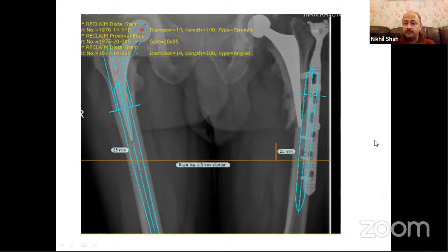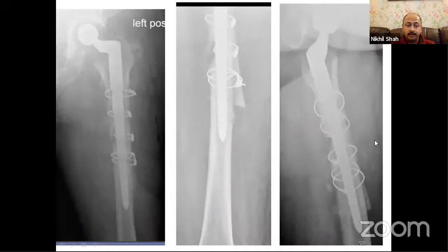So when I went in, unfortunately, the proximal femur, at least the 2 inches of bone below the lesser trochanter, was completely dead. And it was also quite fragmented. But we had excluded infection. So I decided to preserve the tube as much as I can for the benefit of preserving the abductors. And this is what I did. A revision using a stem that was adequately long to get good distal fixation, an anterior strut, DBX and DBM, and tried to assemble the proximal tube as best as I can within the limitation of whatever bone was available.